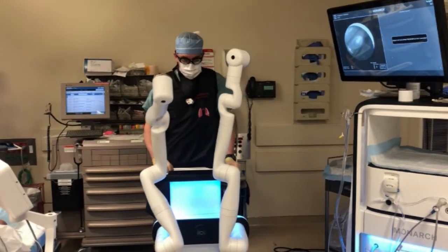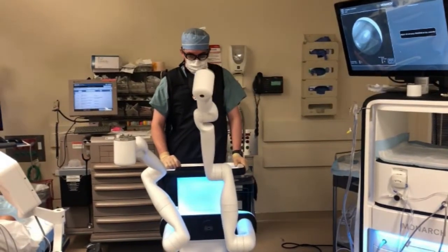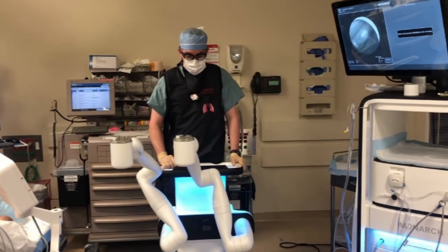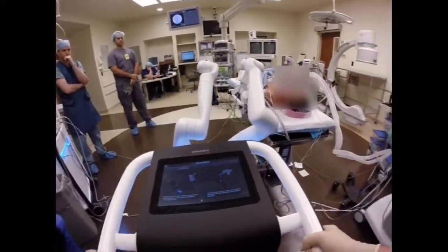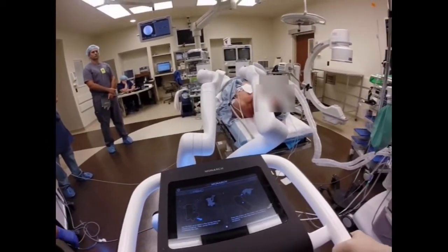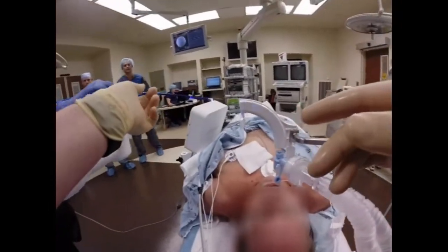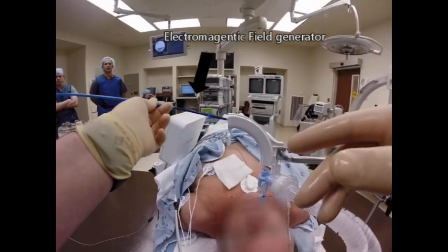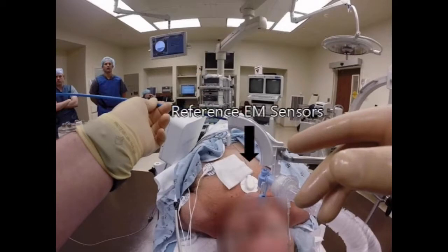This video depicts the unstowing of the robotic arms in preparation for the procedure. The robotic arm is then docked to the endotracheal tube holder at the beginning of the procedure. The figure depicts the electromagnetic field generator as well as the electromagnetic sensors that monitor chest wall movement.